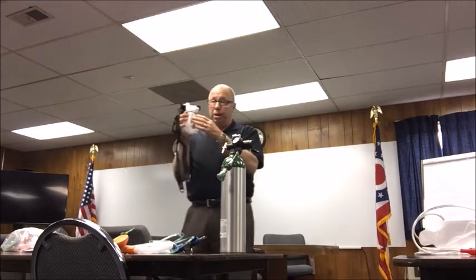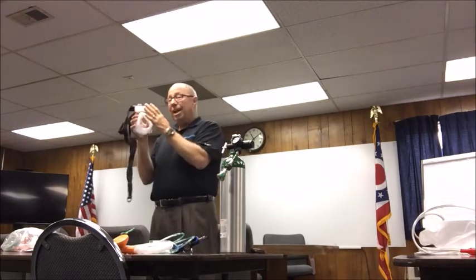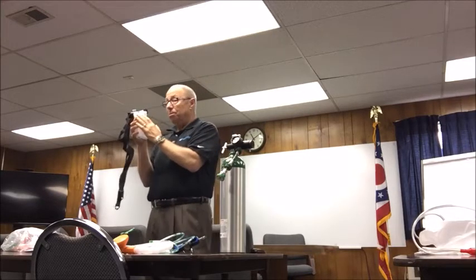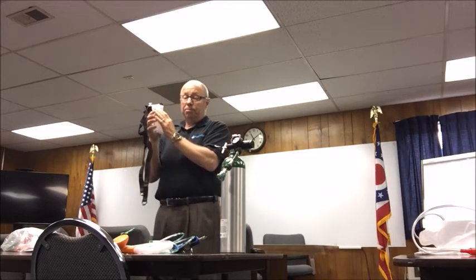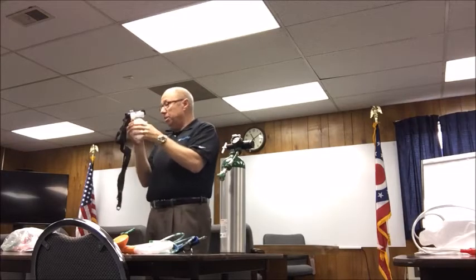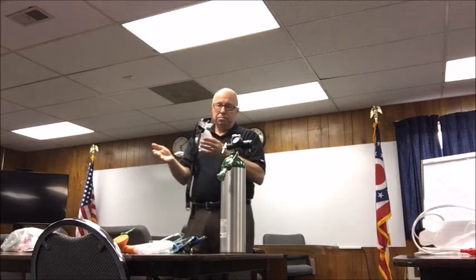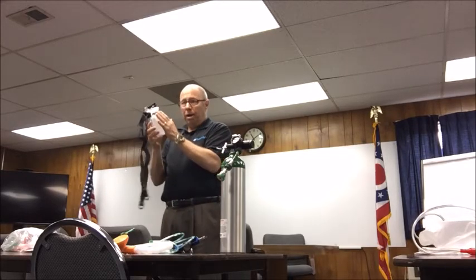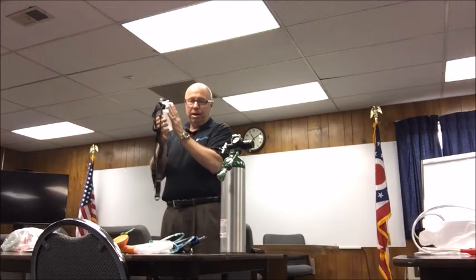So men with facial hair, you will be able to get an adequate seal to deliver CPAP. It won't be a perfect seal, but you'll be able to get an adequate seal. One of the other advantages is if you're using end-tidal CO2, capno line, it will seal around that line and you'll be fine, okay?